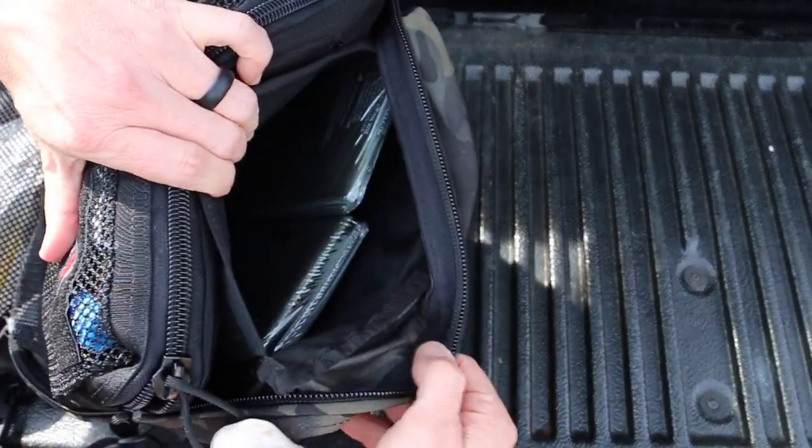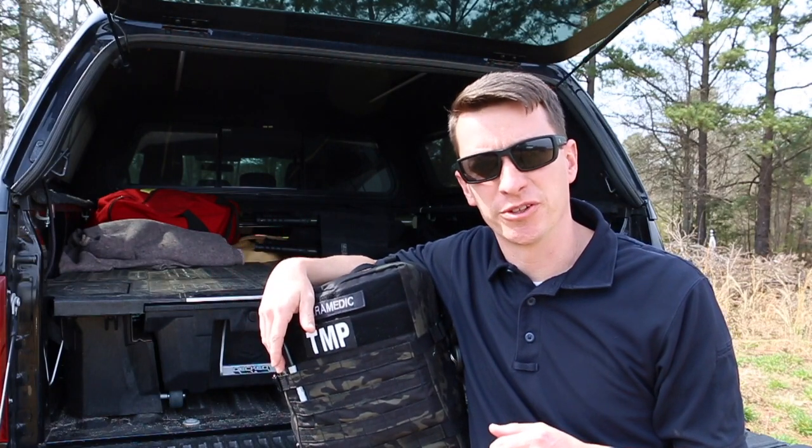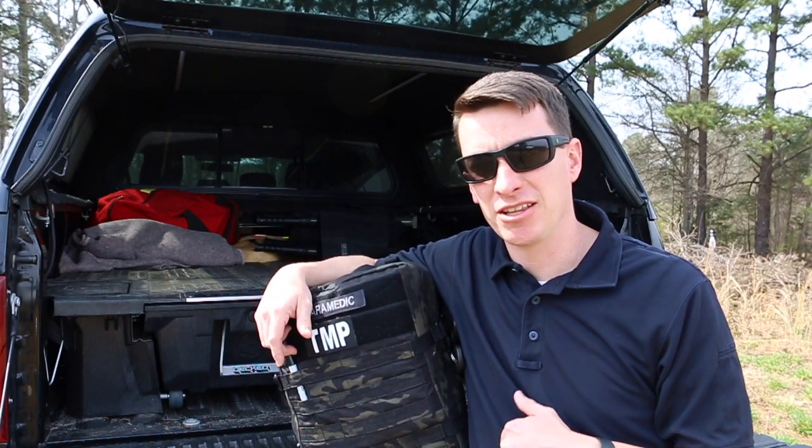Down below everything, I have two SAM splints tucked away in case I need them. I hope this video helped. You never know when you'll be the first responder, so remember the right gear and the right training. And for those of you watching who think I'm missing something from my kit — I have four different bags in my truck in different styles, so I probably have it covered.